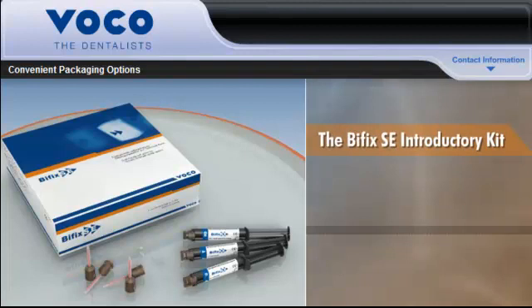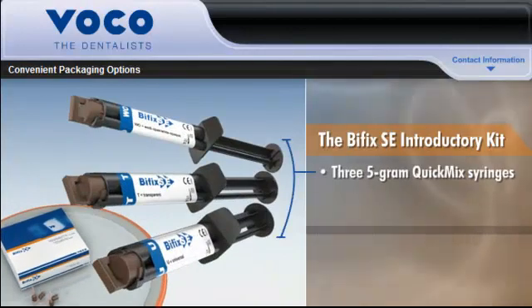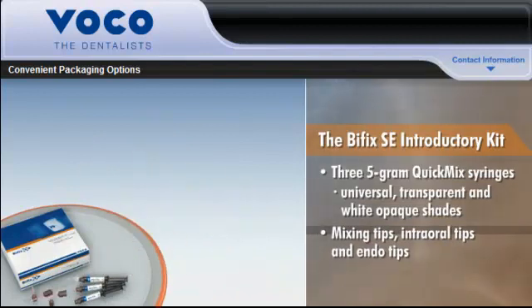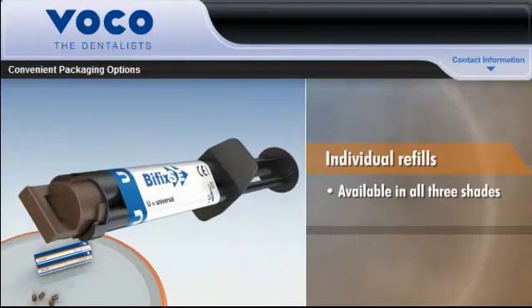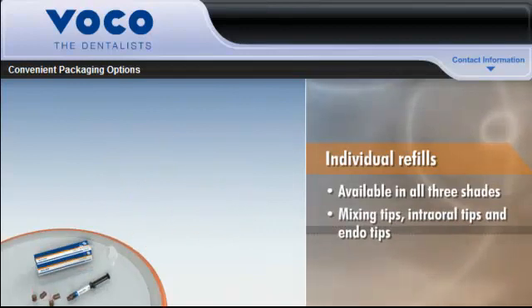The Bifix SE introductory kit contains everything you need to cement your restorations with full confidence, including 3 five-gram quick mix syringes in universal, transparent, and white opaque shades, mixing tips, intraoral tips, and endo tips. Individual refills are available in all 3 shades, with each refill package containing mixing tips, intraoral tips, and endo tips.